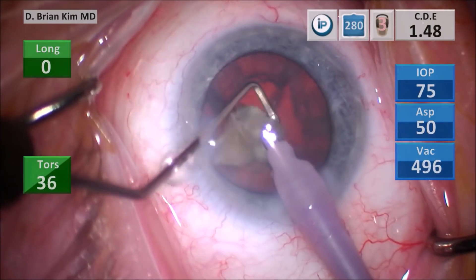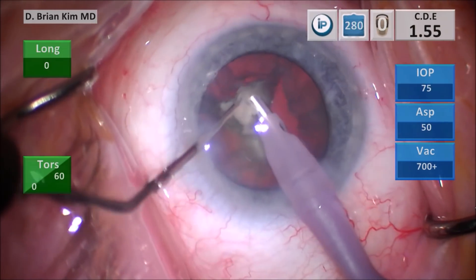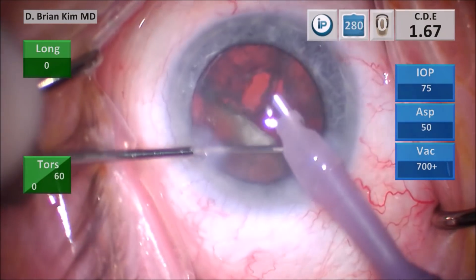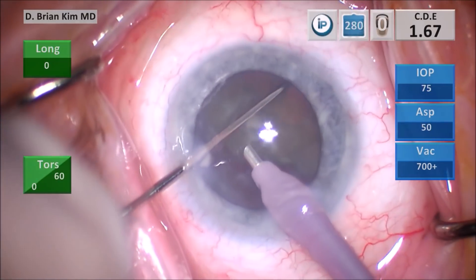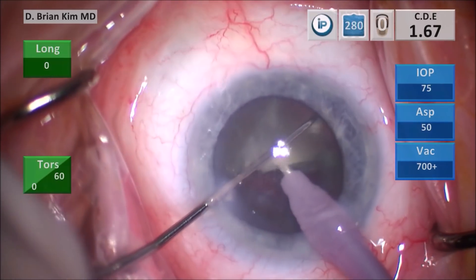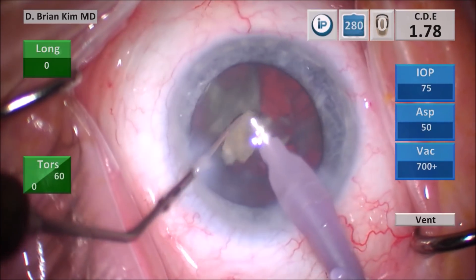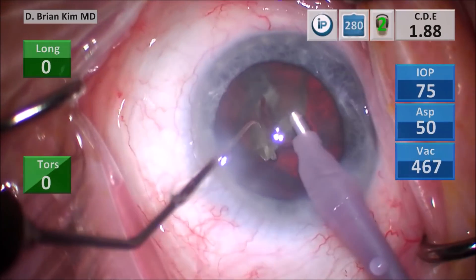The key is to direct the lens material between the two instruments — you're crushing, and once you're getting the pieces small enough, you go ahead and emulsify the lens material. I'm pulsing the phaco tip and the vacuum as I go. I'm spinning this last hemi-nucleus in front of me and placing the chopper out to the equator. I'm going to place the phaco tip pretty deep in the capsular bag. As I crush the lens material, bringing the instruments together, it breaks up very nicely.